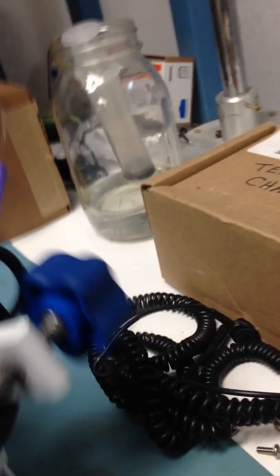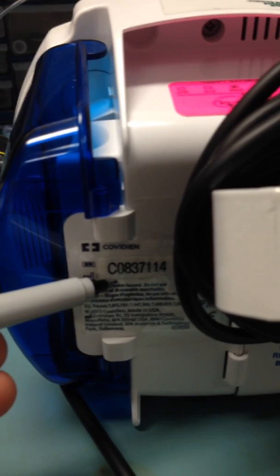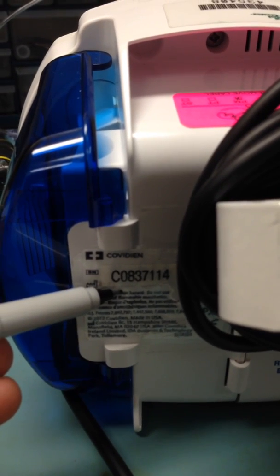We're going to start writing the information on the feeding pump. Behind the feeding pump there is a serial number, and it's going to be located right here — usually behind the pole clamp. The serial number on this device is C0837114. We would write that right here on the form.